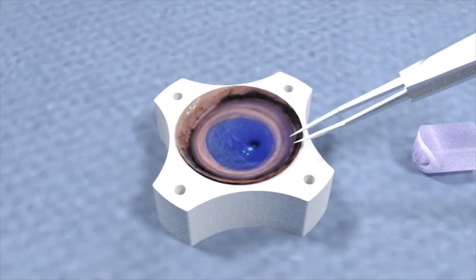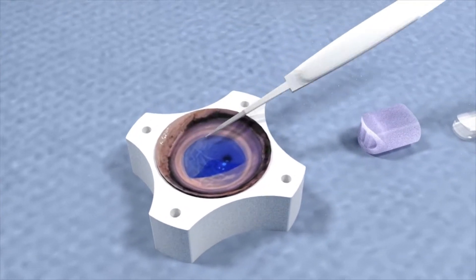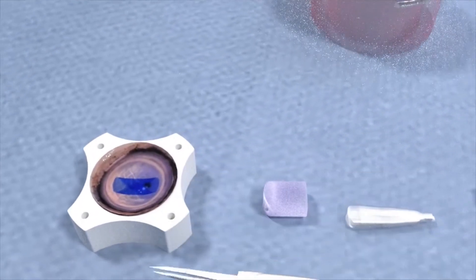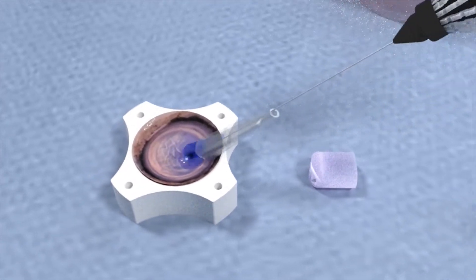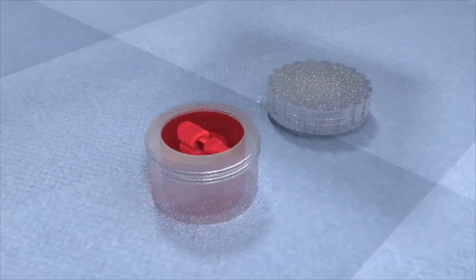The tri-fold technique folds the graft opposite the way it naturally wants to scroll, similar to folding wrapping paper with the design facing inwards. Eye bank technicians then load the tri-folded graft into the inserter, place on its cap, and ship it in storage media.